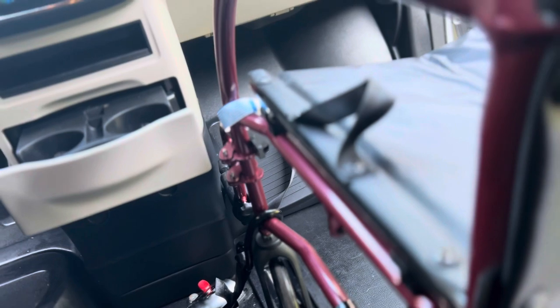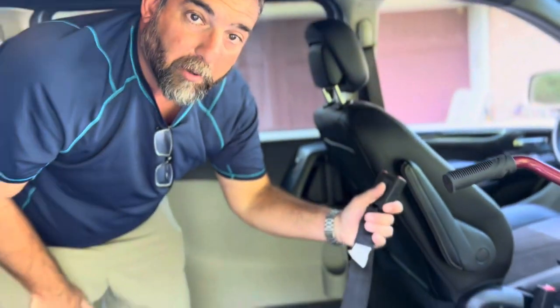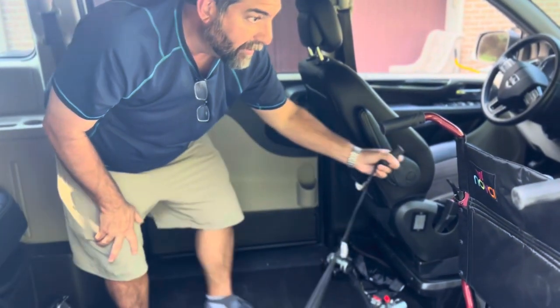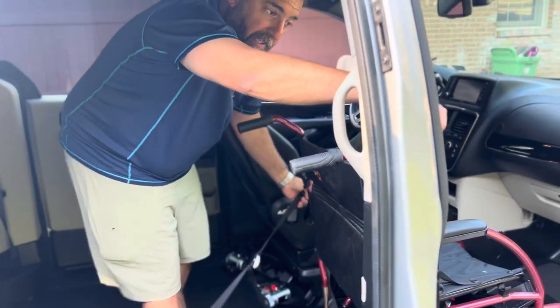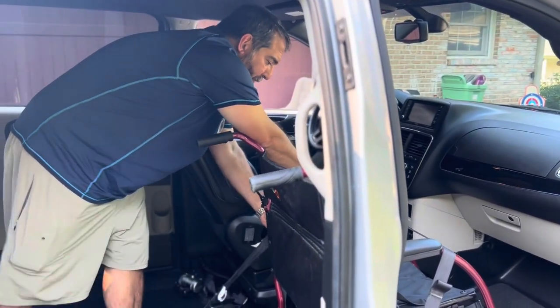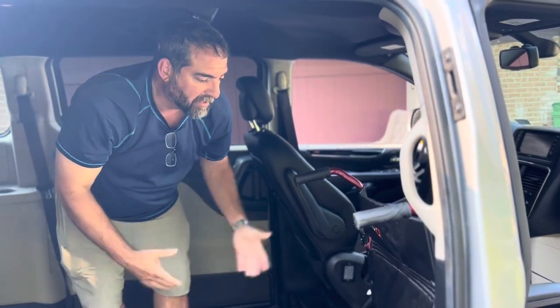Finally, step four is to buckle the passenger in. The seat belt buckle is back here and the seat belt itself is in the place where you would normally expect it. You simply put the seat belt over the person and buckle it. Four steps — secure passenger.